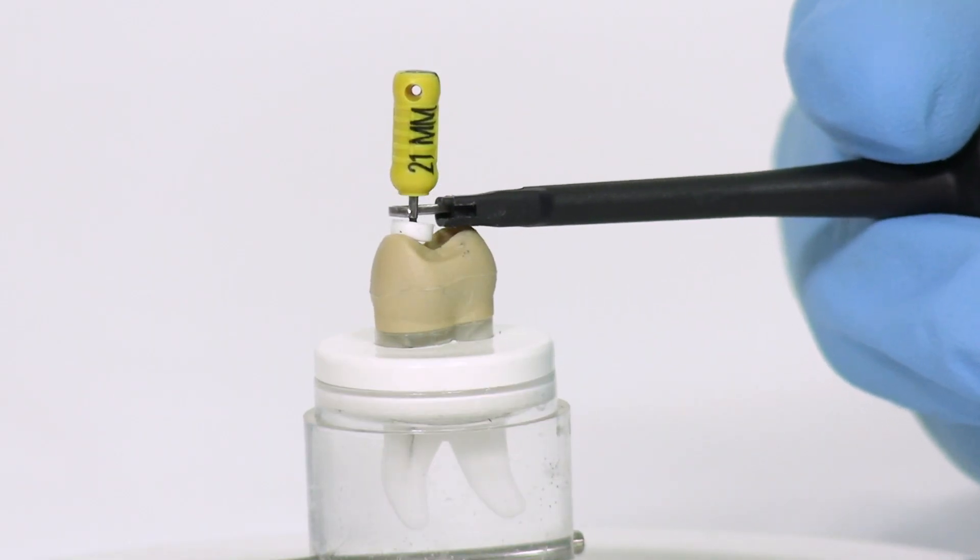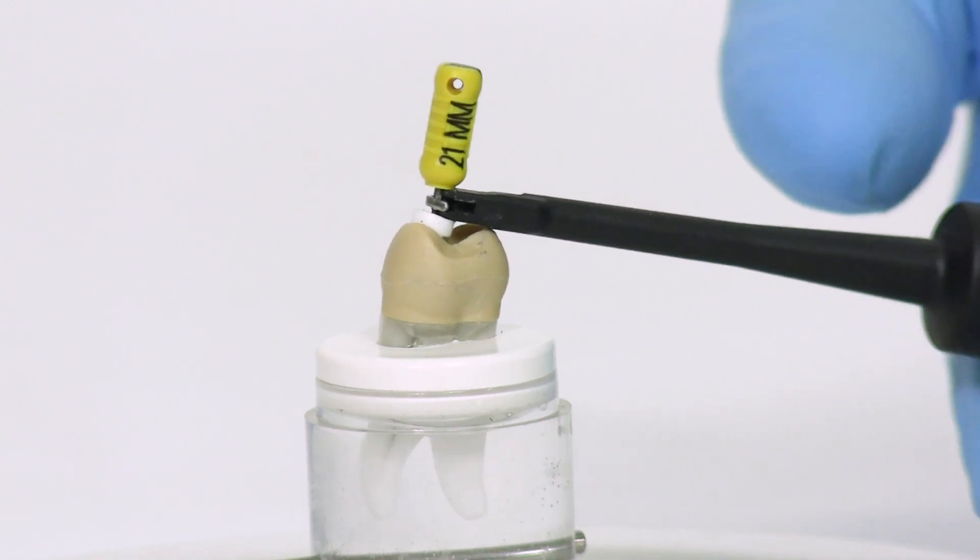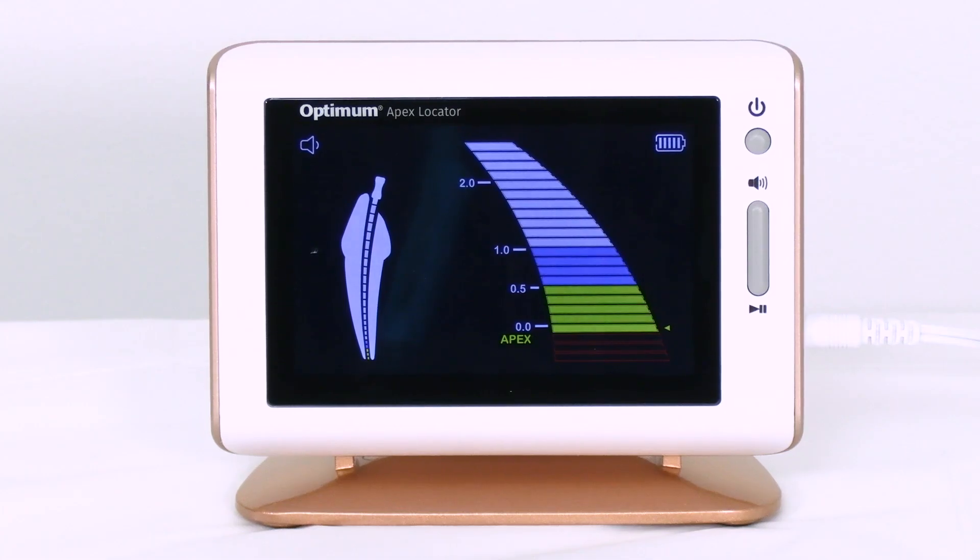Clip the file with the file clip and approach the apex. There will be a continuous alarm when the distance is less than 2 mm. When the indicating bar reaches the position of the dial 0.0 and the apex is displayed on the screen, the endophile has reached the anatomical apical foramen.